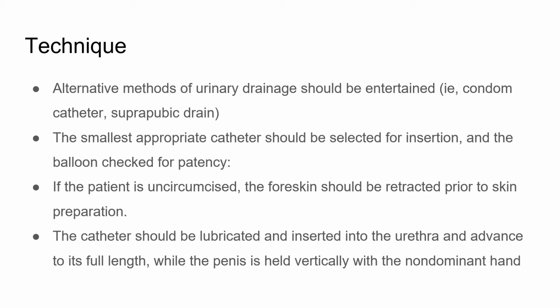Then the smallest appropriate catheter should be selected for the insertion. So why has this to be done? Because as it has to be kept for a longer duration of time, it may widen the urethra. So as far as possible, the smaller catheter should be selected, and the balloon is checked for patency. Before inserting, the balloon has to be checked.